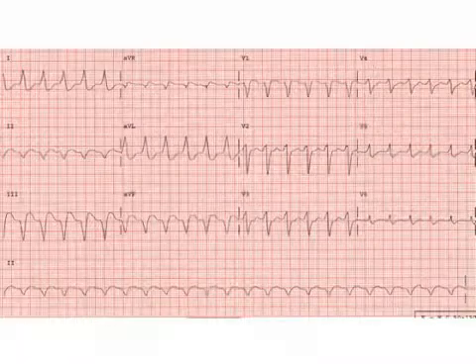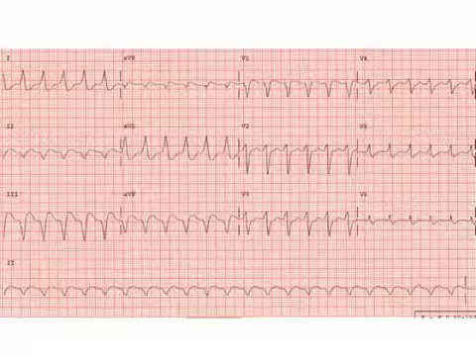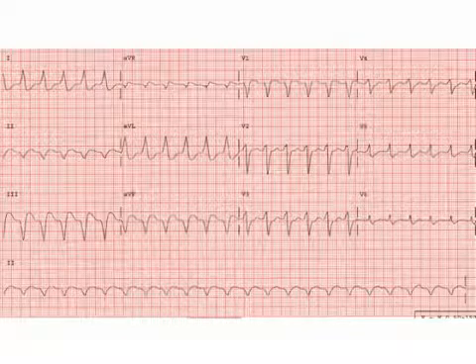We have 3 examples of it for you, and you'll notice that they don't look exactly the same, but I think we can all appreciate that they're wide, they're very fast, and again, this is an example of a rhythm that you will recognize very quickly if you see this just a few times.